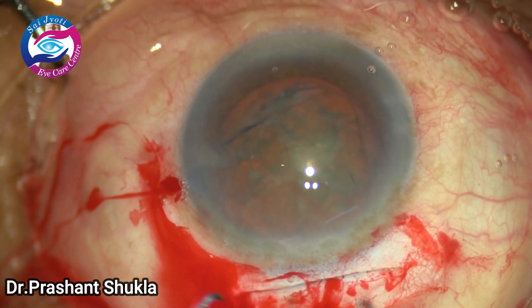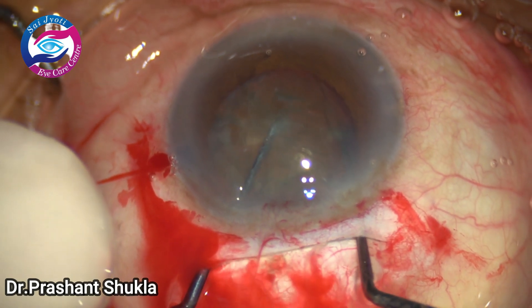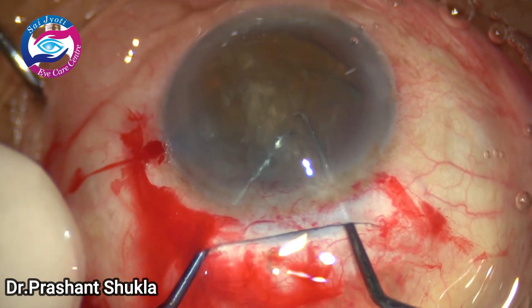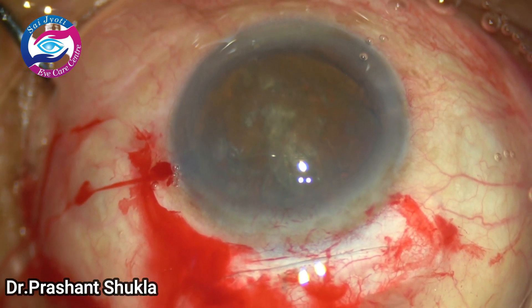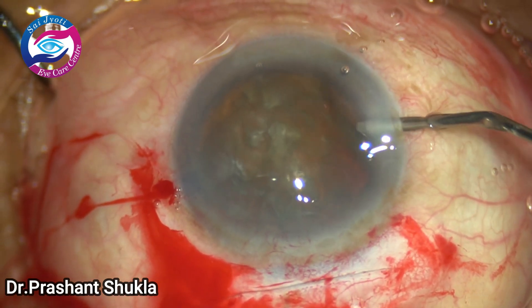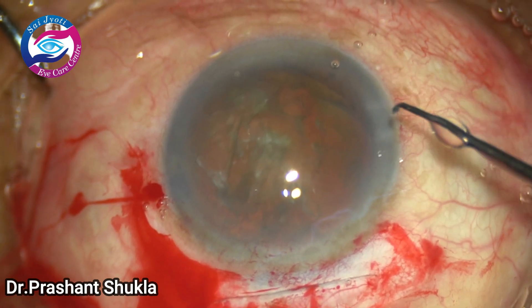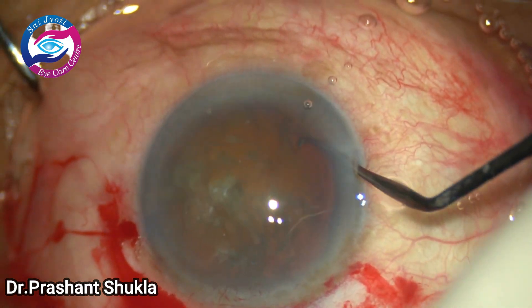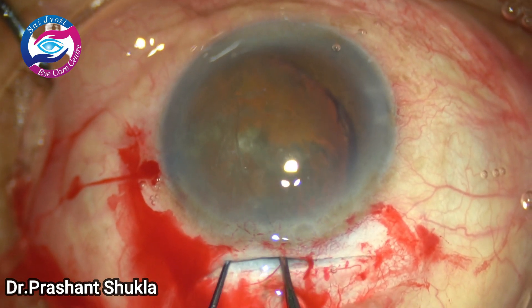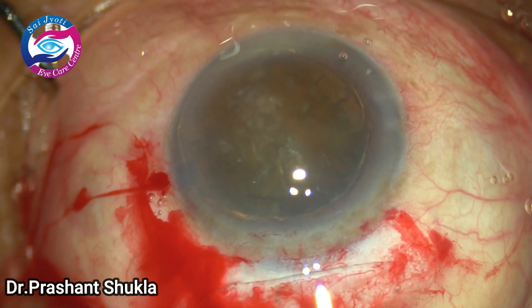Now is the time to remove the nucleus. Here we use the bimanual technique, which is a very good technique. The left Sinskey slides the nucleus on the left side; the right one hooks the equator of the nucleus. With the help of both instruments the nucleus is dialed out. The chamber became shallow so some more 2% HPMC viscoelastic is injected to create space for proper instrument movement. Using the side port one can also move the nucleus; almost the whole nucleus is now in the anterior chamber.